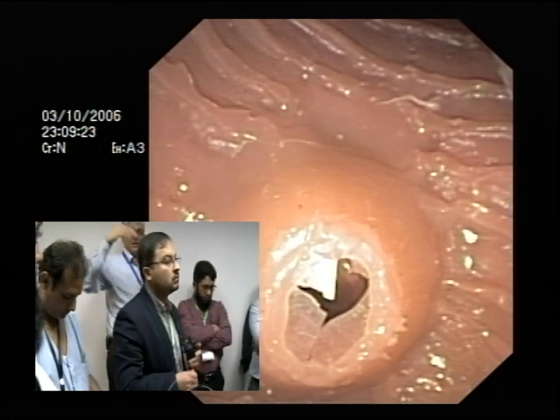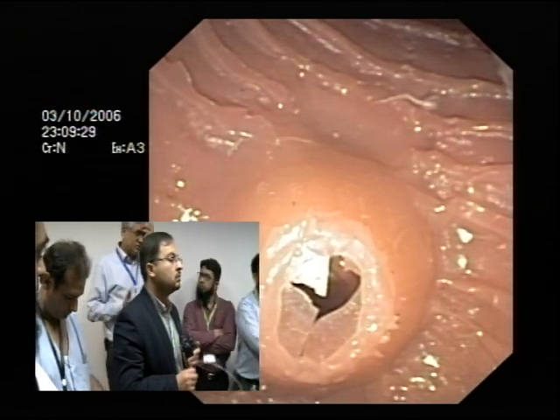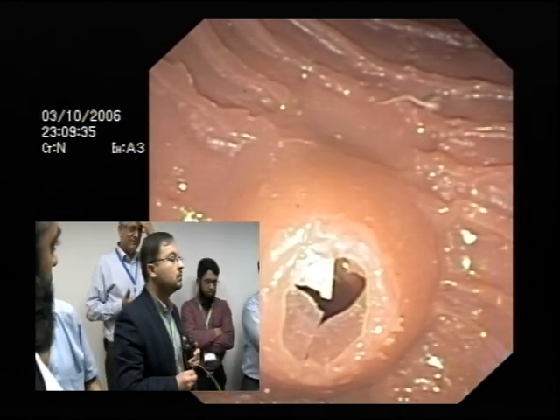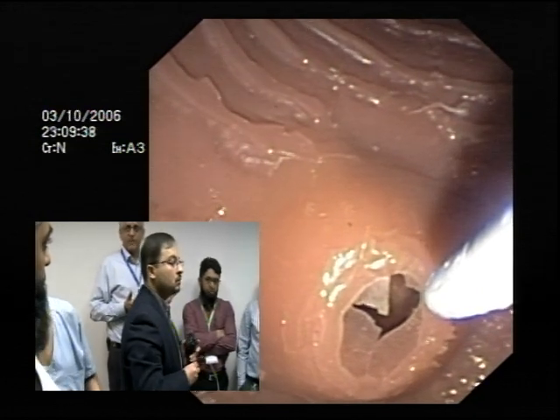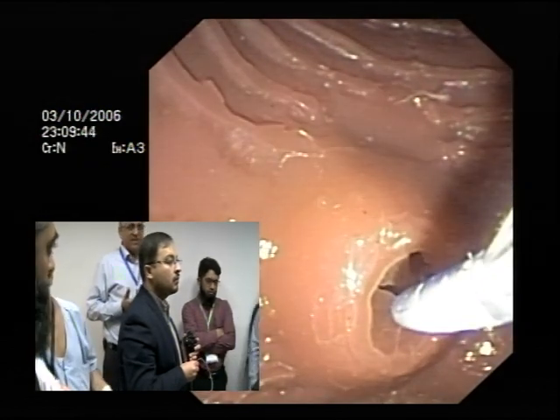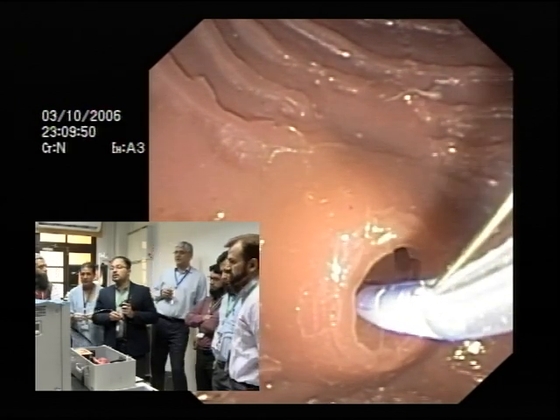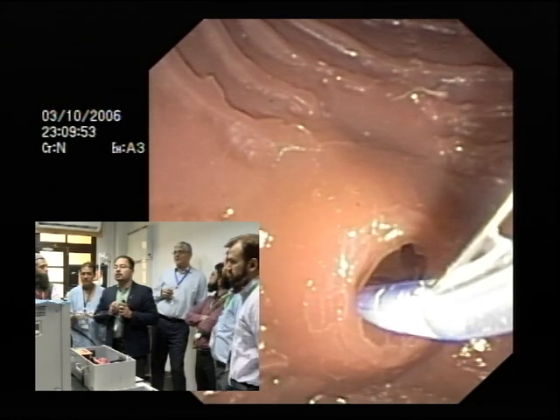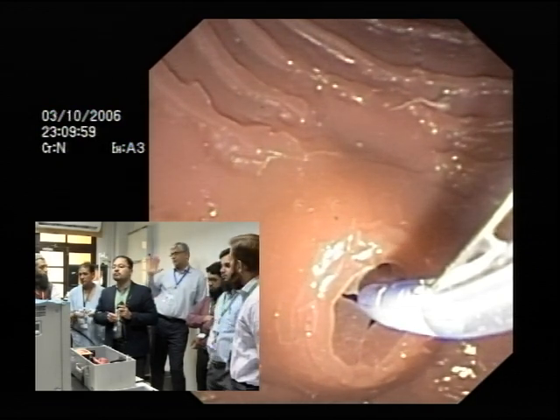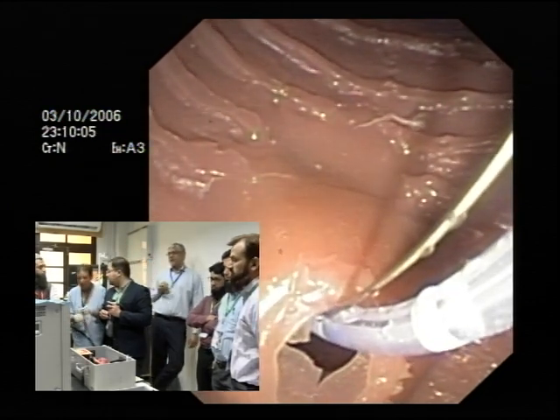Okay, so then we come to techniques of cannulation. So one technique is where you just go in with a sphincterotome or a cannulotome. In our practice since 1996, I have hardly used cannula, for very difficult pancreatic duct cannulation, if I have. But other than that, almost all, my first poster at BSG from Pakistan was in 1997, and that was about sphincterotome cannulation. So we don't literally have cannula, I don't think we have cannula, just for pancreatic.